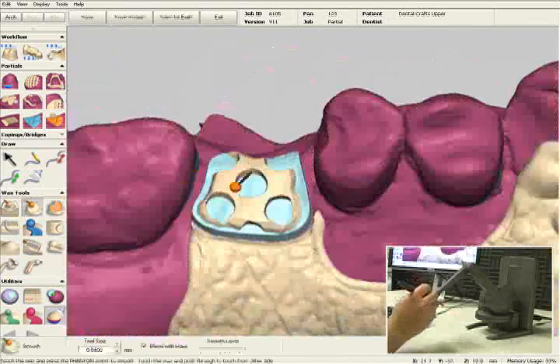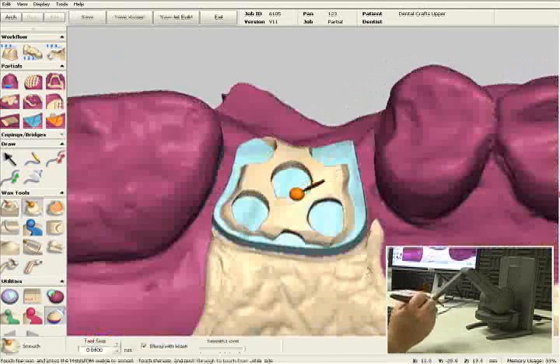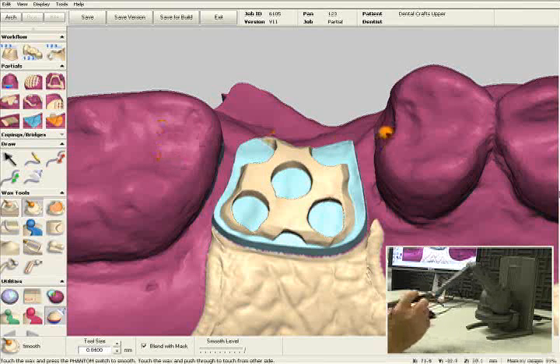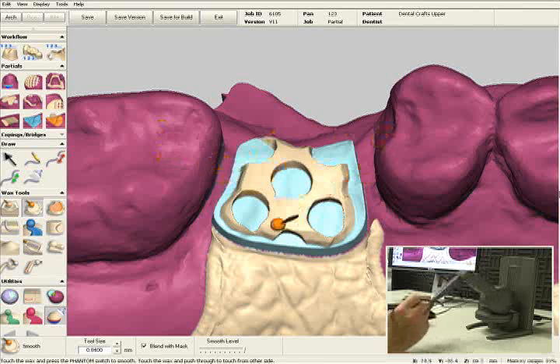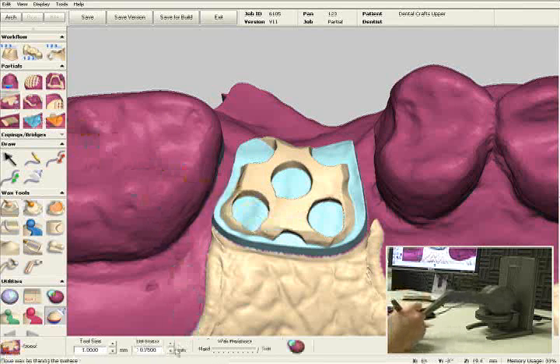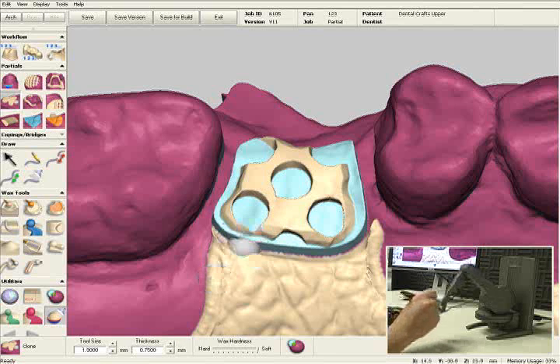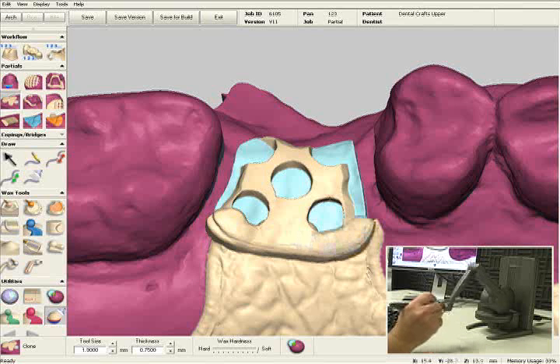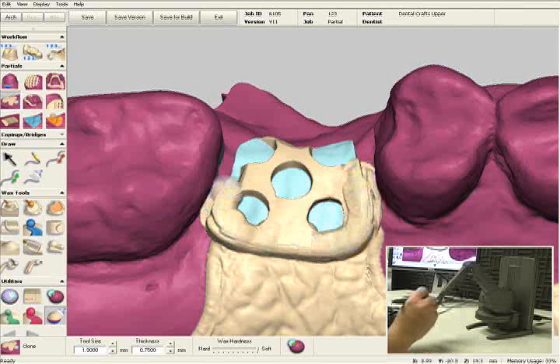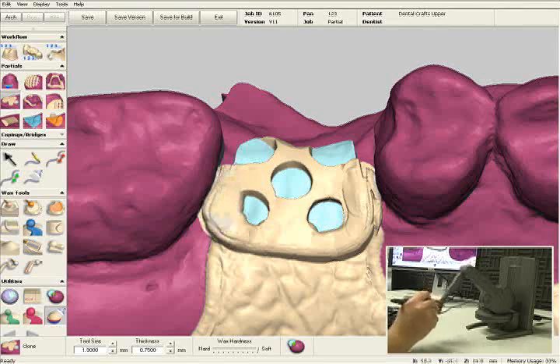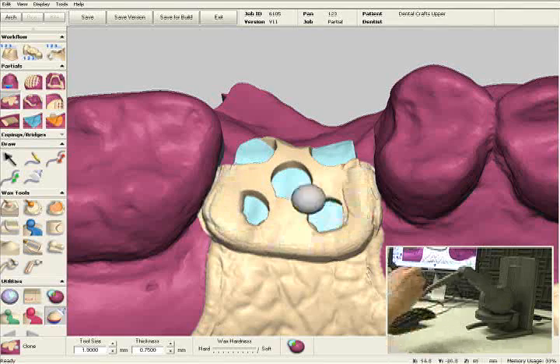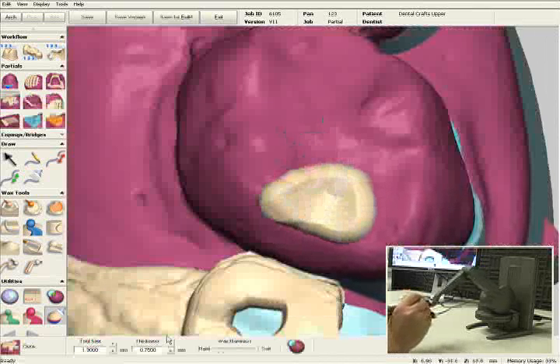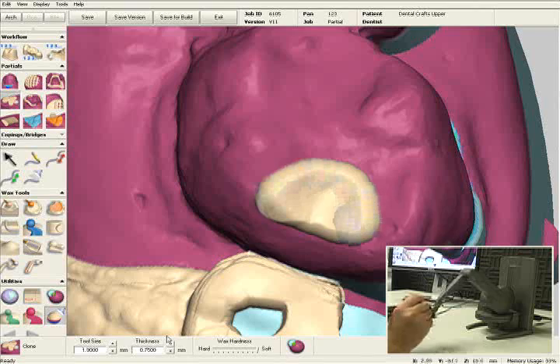Let's do the same thing for the posterior mesh. Here I'd also like to show you how to add digital wax manually to the rest seats on number 2 and number 4, and I'll also add the guide planes. Once again, I'll select the Clone tool — the thickness is already preset to 0.75 millimeters. I'm going to start by connecting the mesh area to the major connector, going into the mesial and distal areas of number 2 and 4, and I'll start by adding a rest seat to number 2. Now I've added three-quarters of a millimeter for the rest seat.